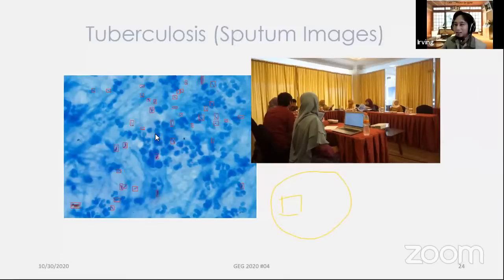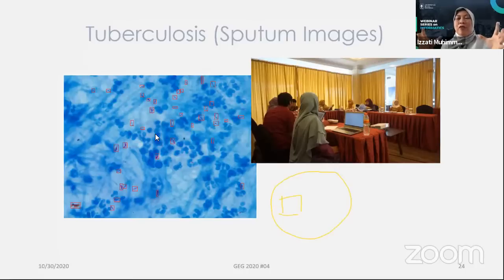Because it's enlarged, maybe 40 times or 20 times, from one view you only take this as data, and then you need to move your slide so you can have that area, and then that area. You move your slide so you can have 100 pictures of that. I see. That's impossible to do without overlapping views manually. That's the demand they ask.